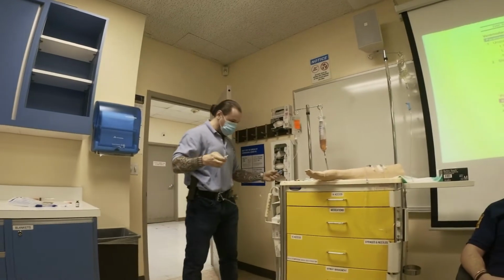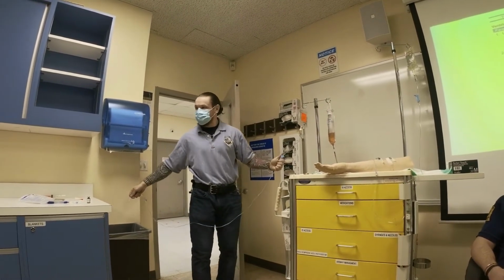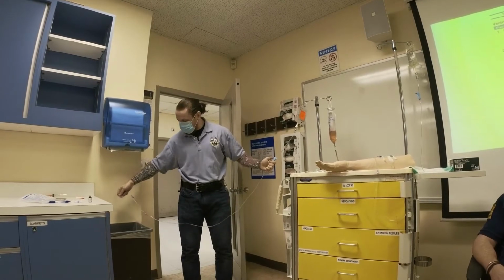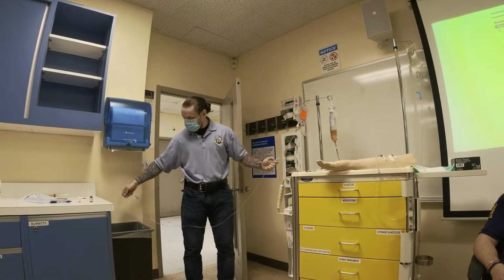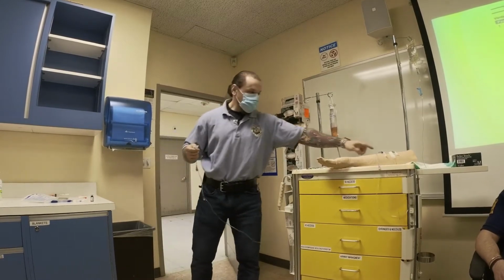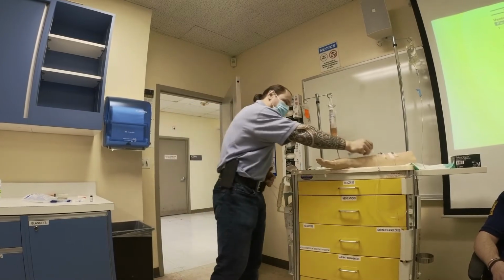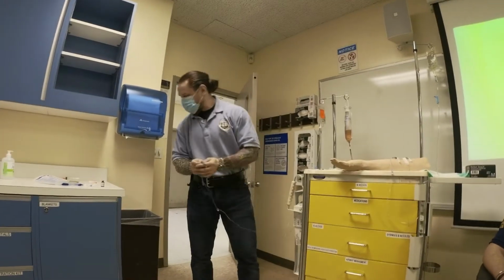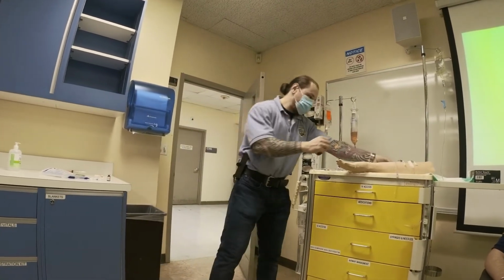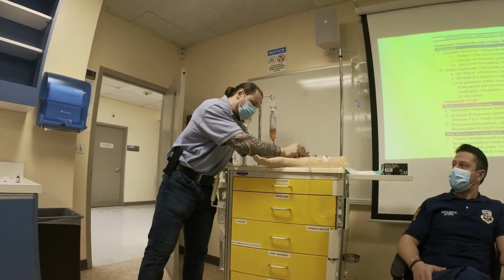So what I would do is 1.66 times 3. That would be like 4.98. That's about 5 drops every 3 seconds, right? Now, notice I'm not going to mainline this. If you guys start IVs, don't ever mainline this. You're always going to put it where? Piggyback, right? But there's one thing I got to do before I piggyback it.